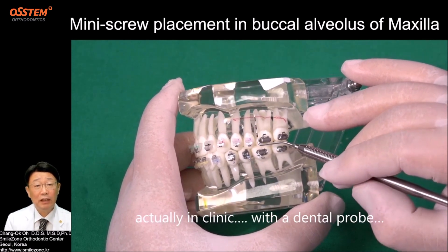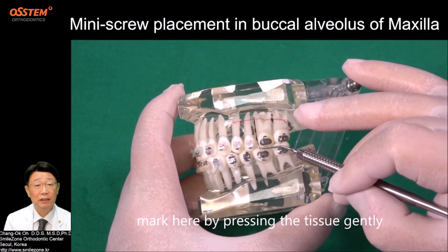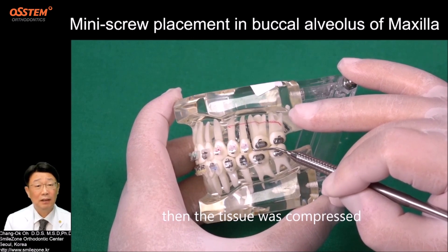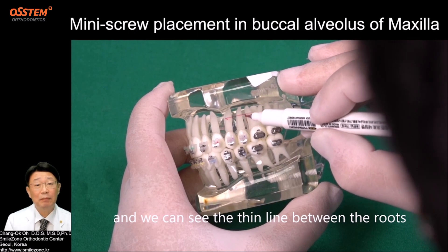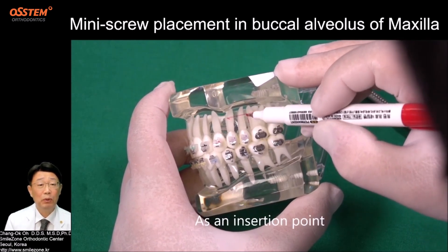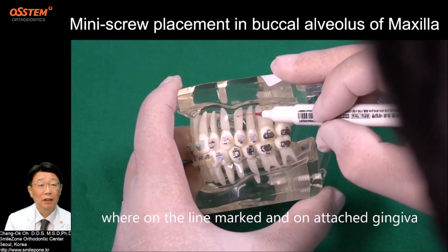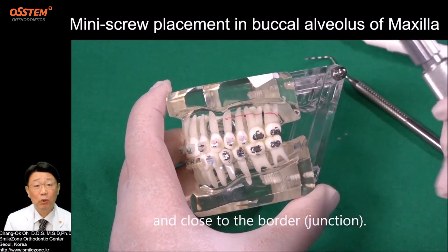In the clinic, with the dental probe, mark here by pressing the tissue gently. Then the tissue is compressed, and we can see the thin line between the roots. As an insertion point, I am going to choose a dot where the mark underlies the attached gingiva and is close to the border.